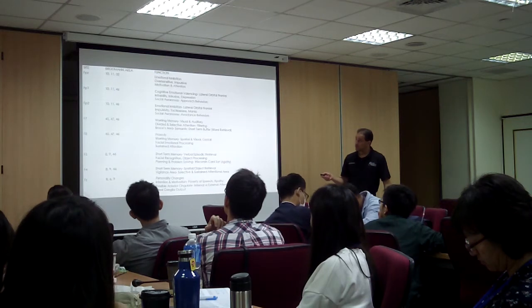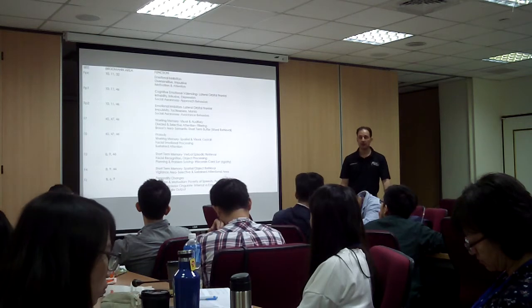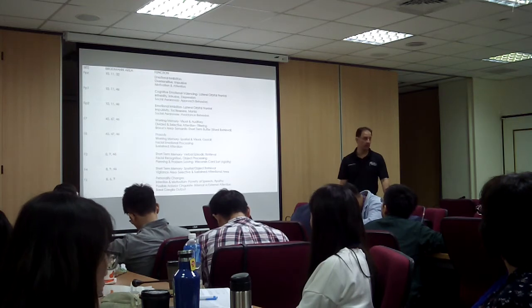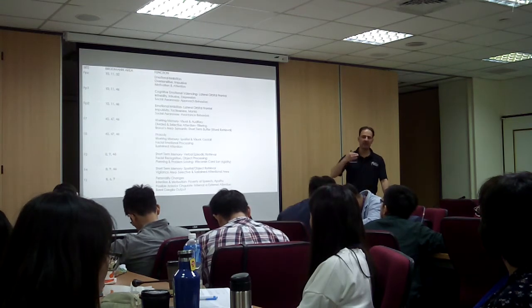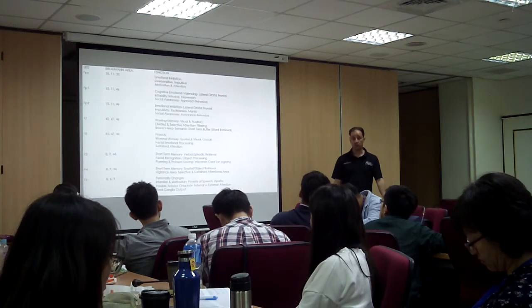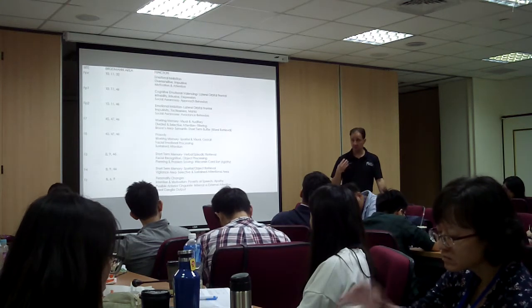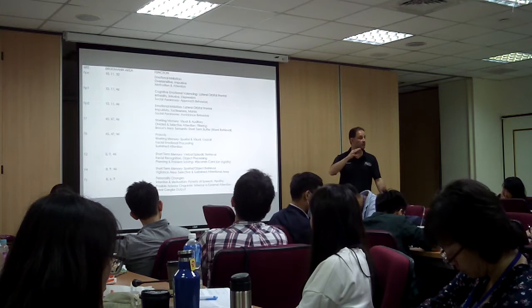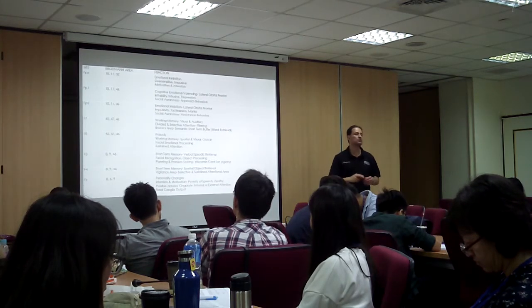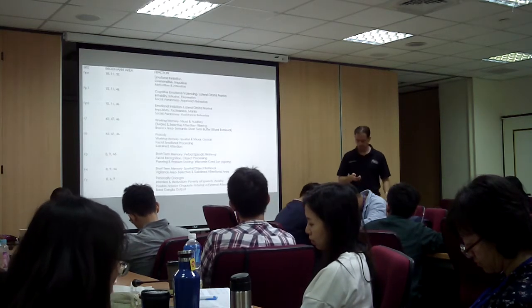Now FP2, same thing but on the other side. You can do it for fear. And people with generalized anxiety disorder benefit a lot from FP2 training as well. Especially inhibiting and downtraining anything that's fast. Okay? Those people respond very well. And you use relaxing music. You know, if they're doing well and if the brain is doing what we want, the music keeps playing. If the brain goes the other way, you can set up a tone that goes ee, and they go, oh no, I need to relax, or simply just the music stops. Okay.